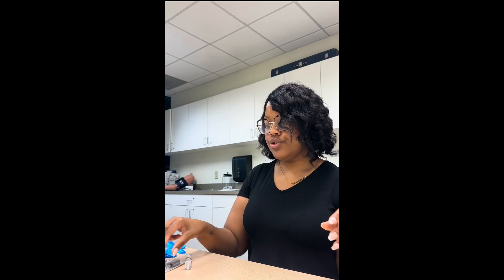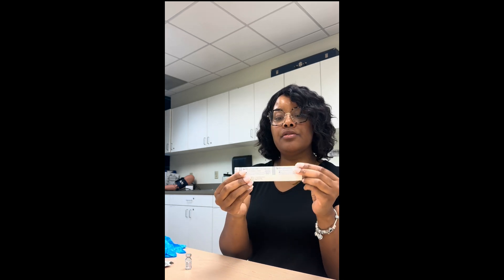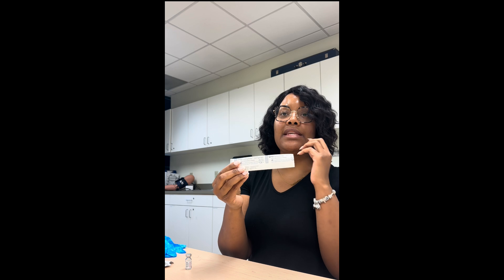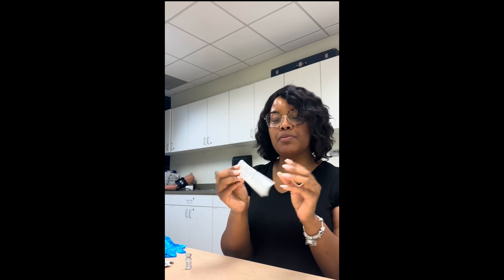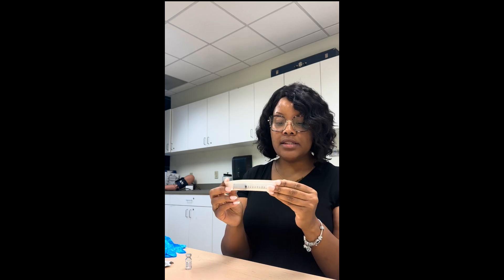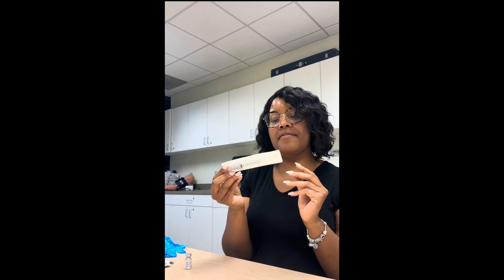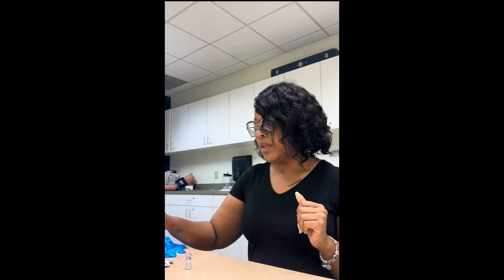Or you can choose this syringe right here, which you will see mostly in hospitals. This one is a 27 gauge and it is a half inch. So either one is fine.